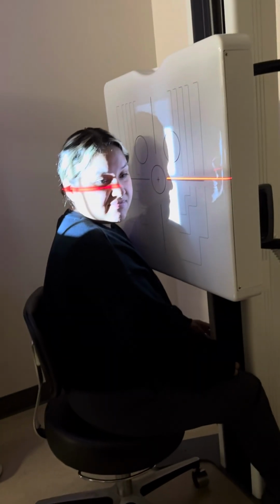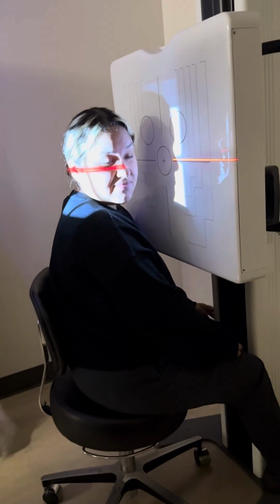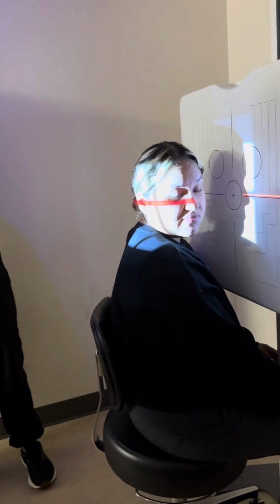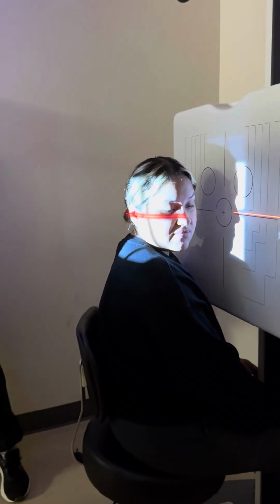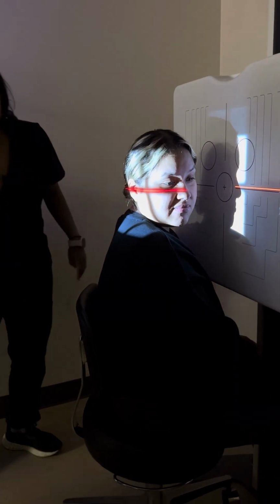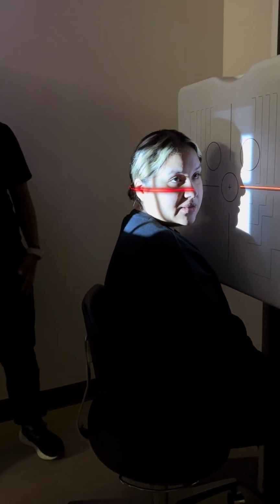So it's in the middle. So you're saying it's close. It's somewhere halfway between the outer canthus and that EAM. Okay. Now, is it perfect? Probably not. Does it have to be perfect? Probably not. You'll get better and better at it.